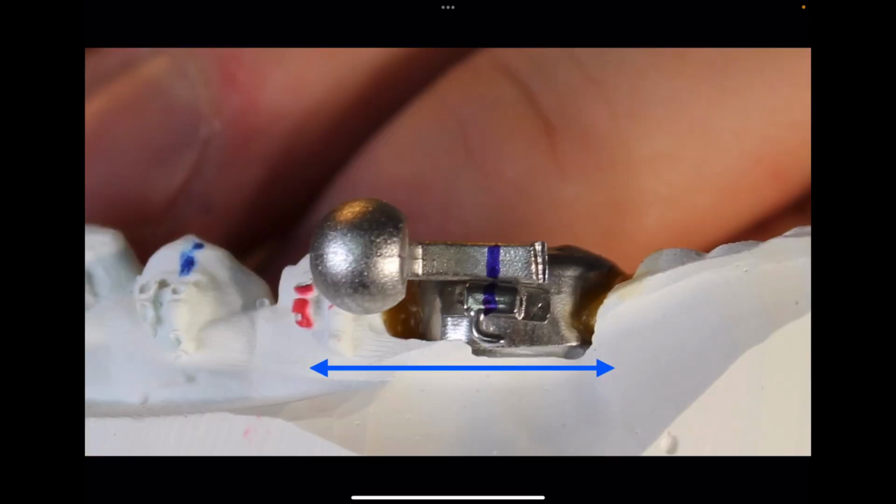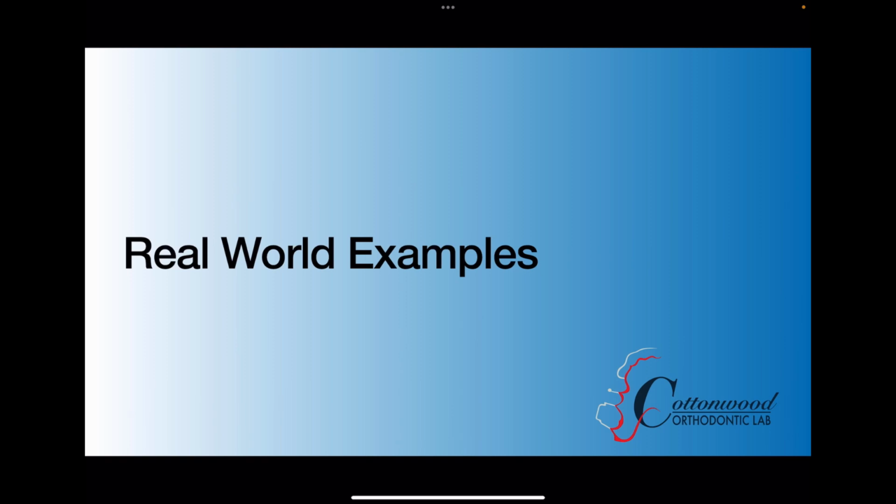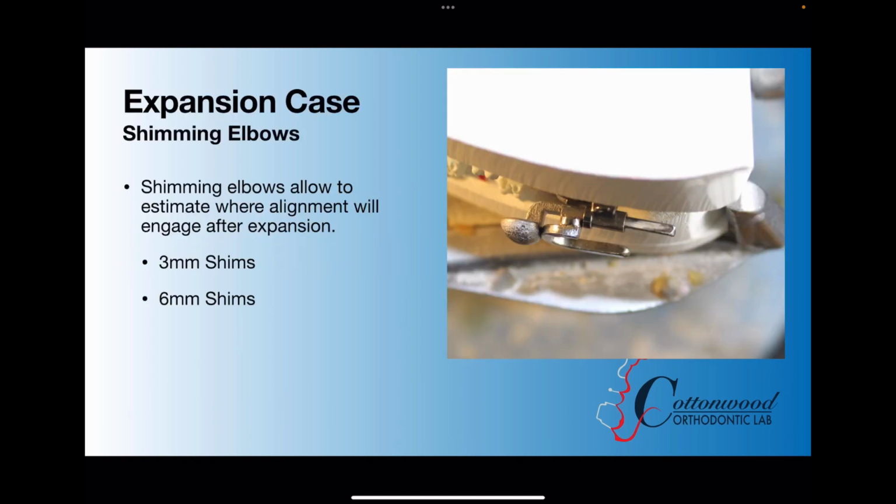Now, if you need to adjust your midlines, please just move your cams. I don't want you moving that archwire tube. I want you to bring those cams forward and back in order to do any adjustments like that. So we have some real-world examples here. Also an expansion case. This is really important.